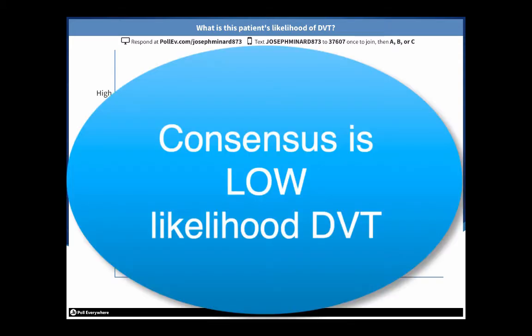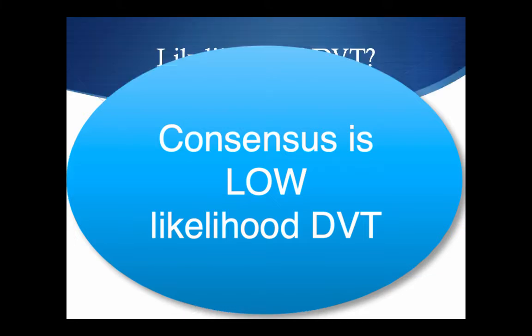So if you signed in, or you can just tell me, or you can pretend you're listening and when you're not, what do you think is her likelihood of DVT? Low. Okay, low. All right, I heard low, we'll take consensus low.